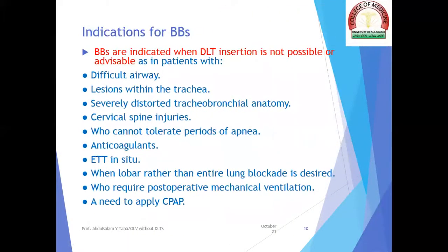Well, whatever type of bronchial blocker is used, there should be an indication. So what are the indications for bronchial blockers?